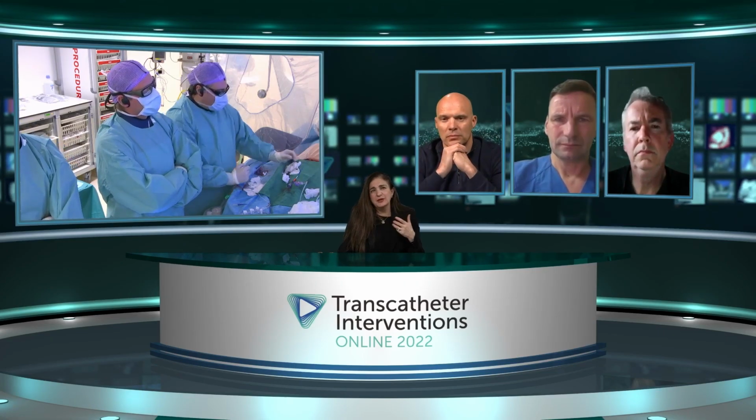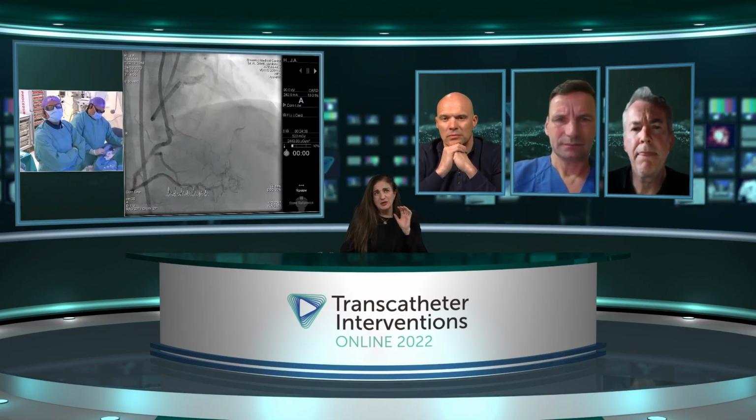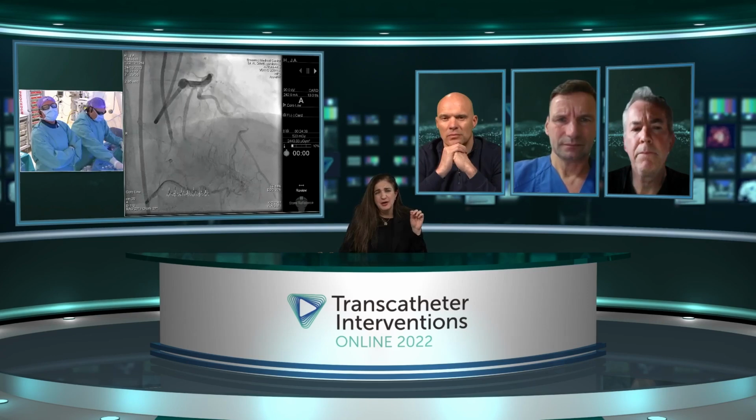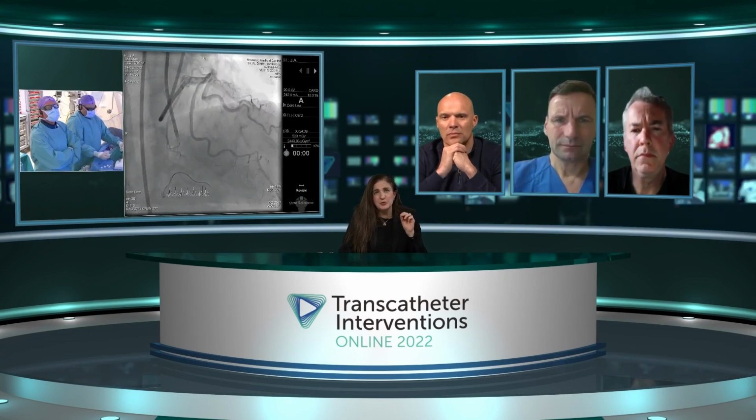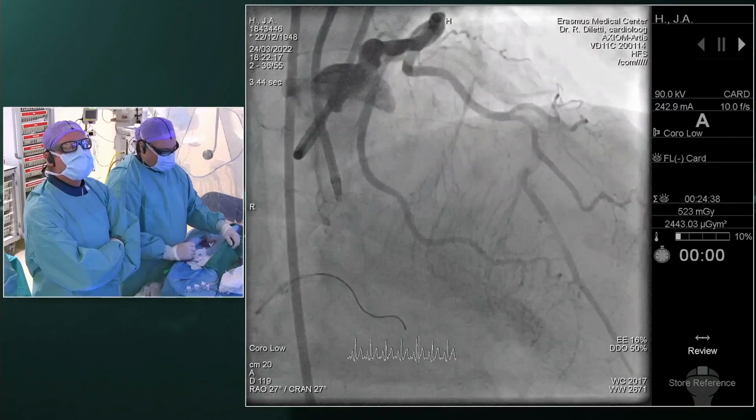Yes, given that it's been such a huge change just from the time of the last angio to now, I think it behooves you to see what's really going on in that left main. I don't know what you think. Go ahead. Sorry to interrupt you.